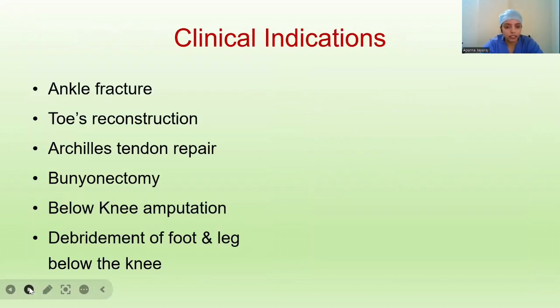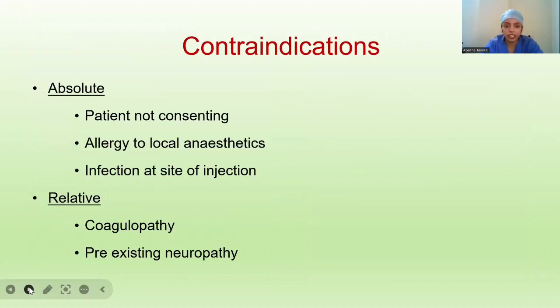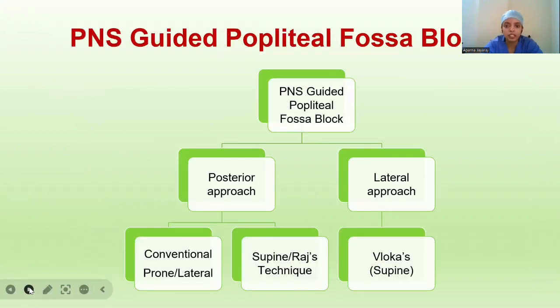Clinical indications include ankle fractures, toe reconstruction, tendinous repair, bunionectomy, below knee amputation, debridement of foot and leg below the knee. Contraindications include patient refusal, allergy to local anesthetics, infection at the site of injection, coagulopathy, and pre-existing neuropathy.